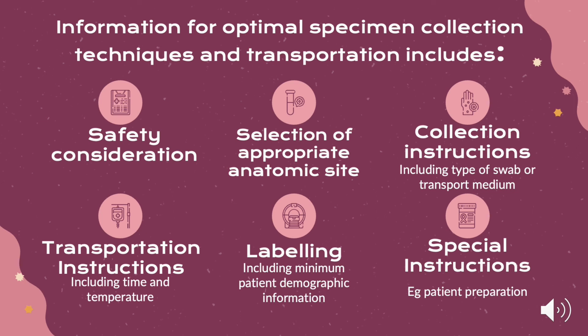Labeling the specimen is another important factor. Information such as patient demographics must be accurate to avoid mistakes. Lastly, if there are any special instructions like patient preparation, they have to be included in the guidebook as well.